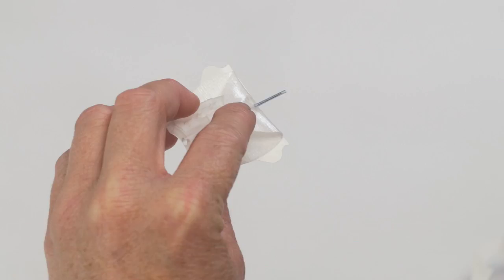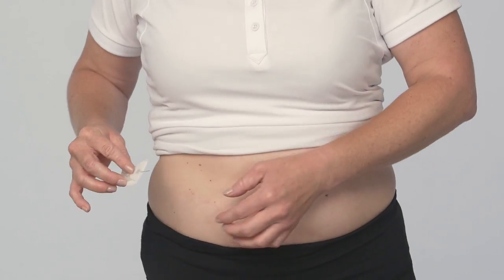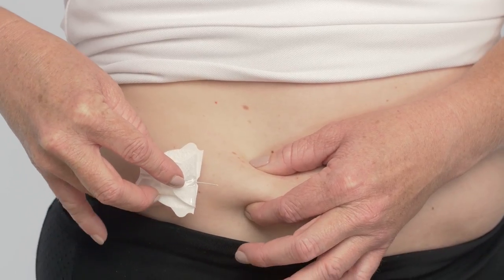Now, carefully remove the needle guard by first twisting and then pulling. Prepare to insert by pinching the skin at your insertion site with one hand to lift the skin away from the muscle tissue.